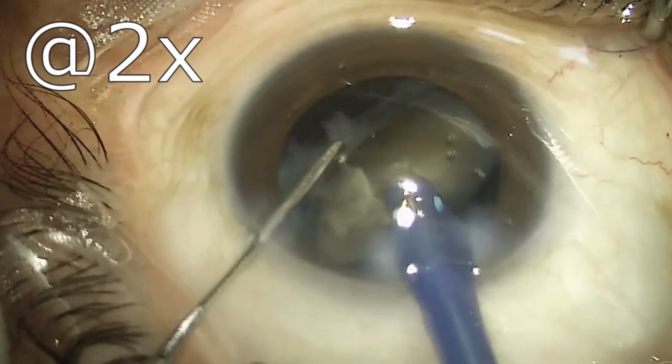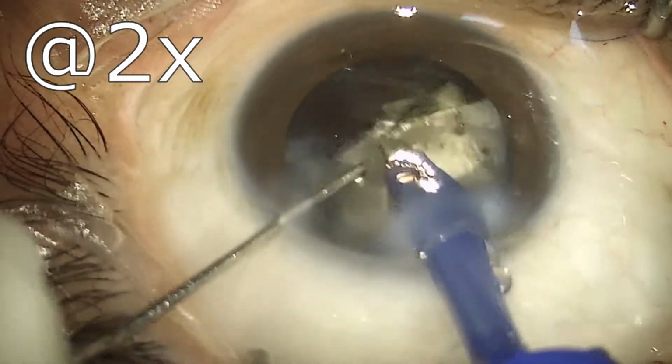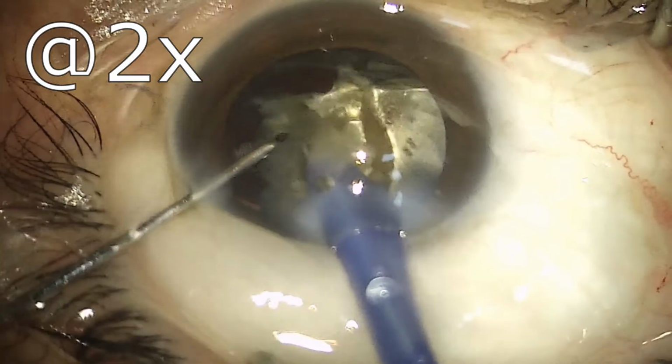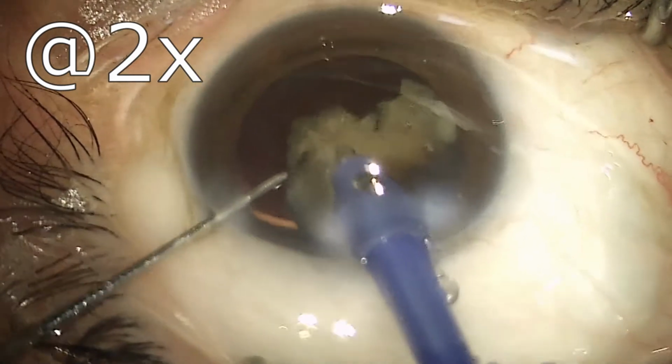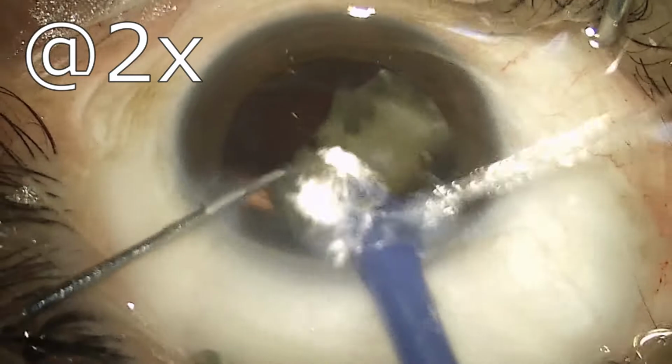The nucleus has by this time been flipped upside down. That makes it a little easier because now the remaining depth can be punctured from this side and you get a better groove.